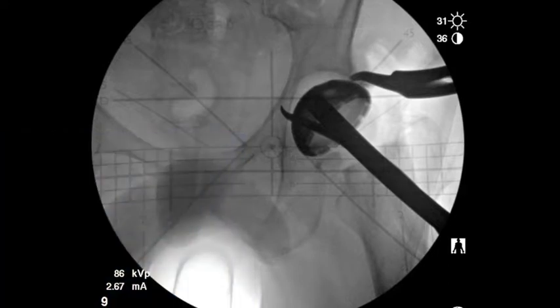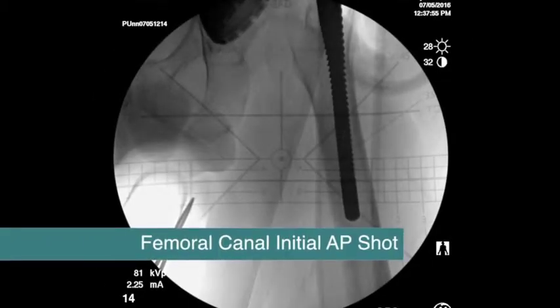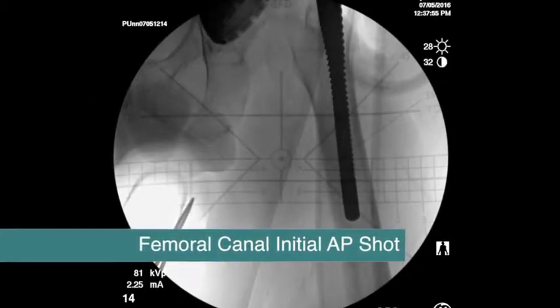I'm looking at the coccyx, that it's centered over the symphysis. Here I can't check the ischia both sides because I'm centered over this cup, but nonetheless you can see that the grid is lined up with the pelvis and the pelvis is rotated correctly. Again, I look at the cup insertion handle, which is straight compared to this 45-degree insertion line, and that should be slightly less than parallel when I'm starting my insertion. I like this cup ellipse in terms of anteversion, but I'll check my anteversion with bony landmarks after I've got the cup in.